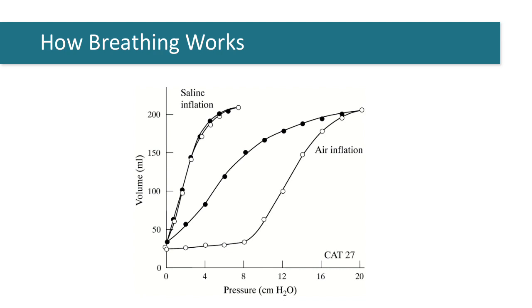As lung volume increases to high levels, the elastic properties of the lung begin to stiffen the lung as it is overdistended, and so compliance is reduced. Ideally, we want to apply sufficient end expiratory pressure to keep the lung volume above the pressure required to open the lung, while minimizing the amount of stretch that we apply to the lung by avoiding overdistension.